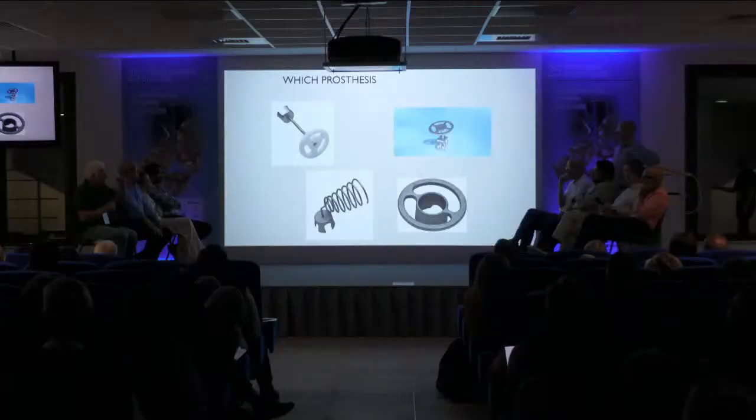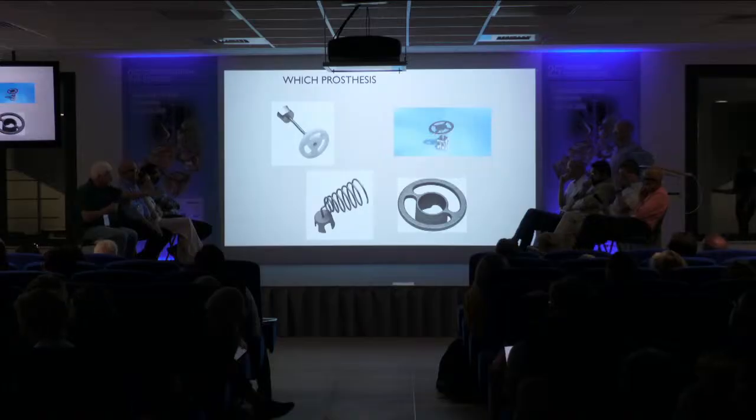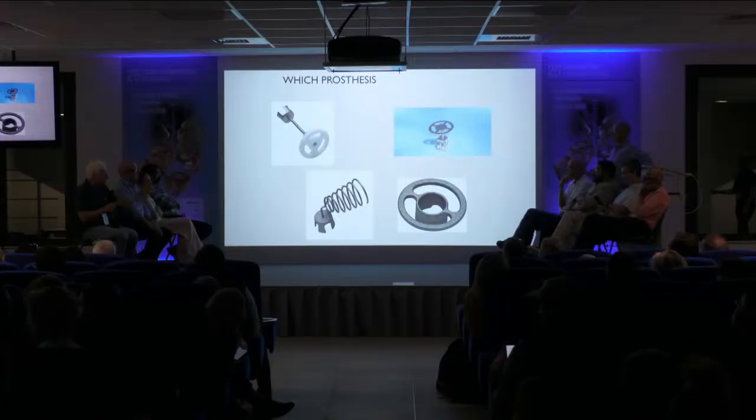Yeah, I use the PORP and with the cartilage on the top. Okay. And you also can use two pieces of cartilage if you don't have the money to buy the PORP. We're considering Brazil public system, so you don't have the PORPs. Then I will use 2 or 3 piled up cartilage pieces from the top of the stapes to the tympanic membrane.